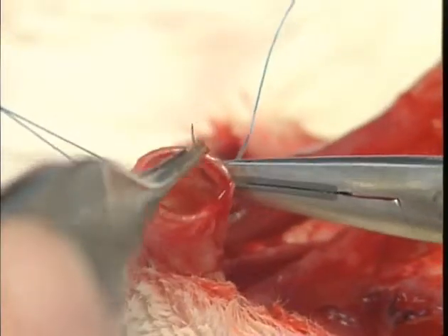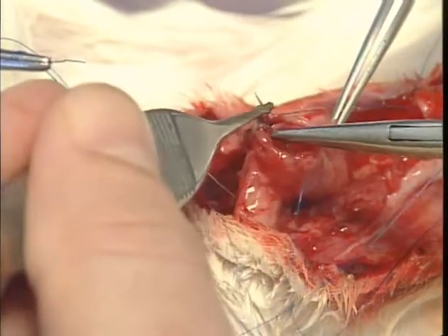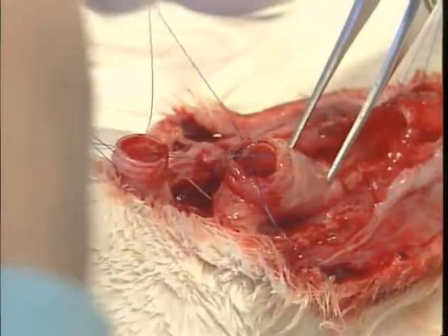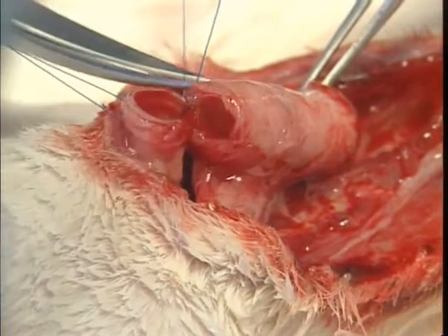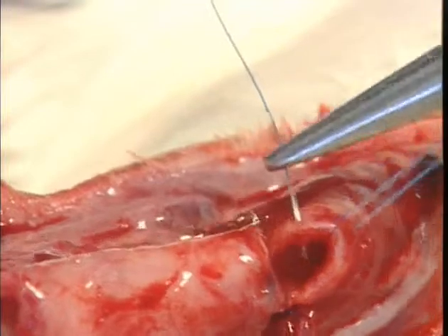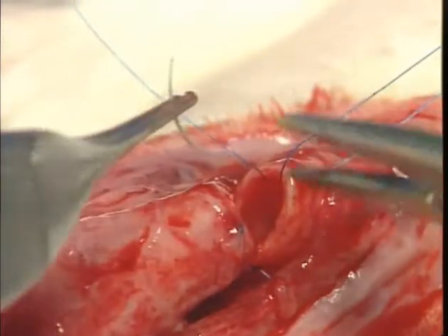The allotransplant is sutured into the tracheal defect with Prolene 5-0. A first suture is placed at the lower anastomosis. A second suture is placed at the upper anastomosis to stabilize the transplant.